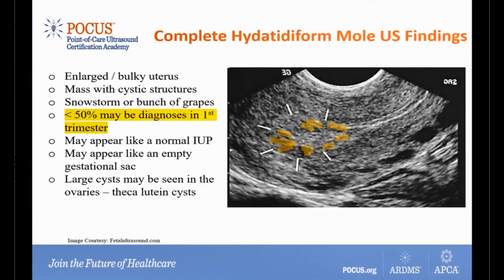And do not confuse with these. These are actually on the side. Let me draw this right here. And so these are venous lakes, and these are not the hydatidiform mole. So just keep that in mind when you're doing this. But this is actually a mole that's developing, a molar pregnancy inside the uterine cavity.